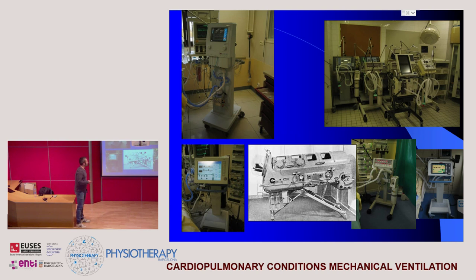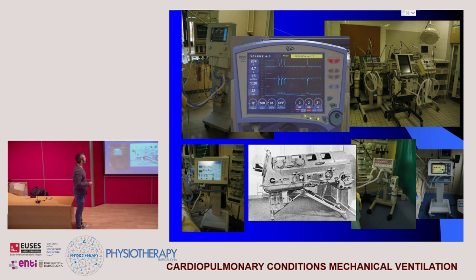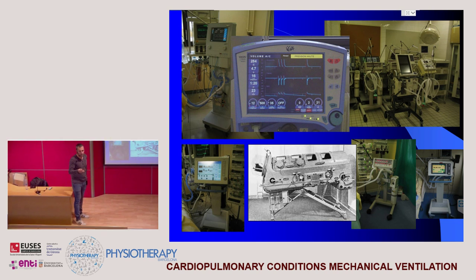A ventilation unit is a modern device. There are old ones, but nowadays we have extremely new software with tactile screens, and several companies are making different kinds of machines.